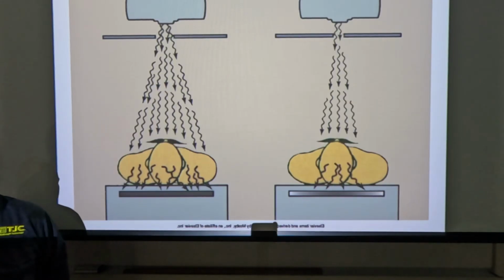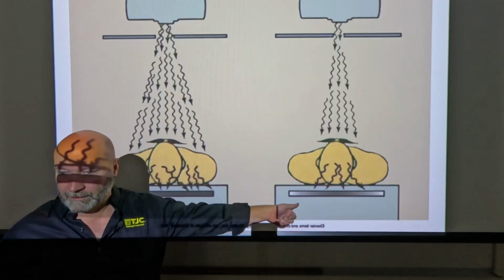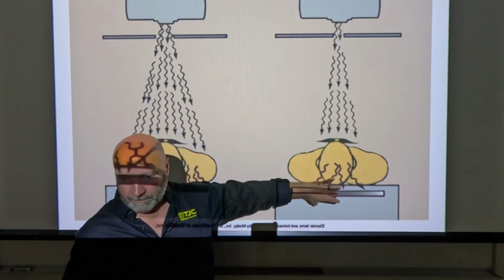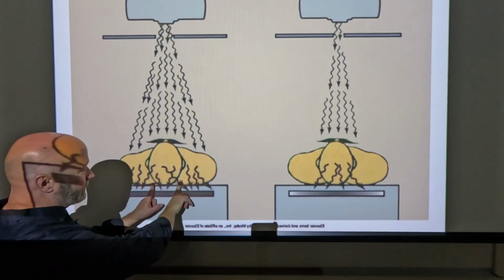I've done well in preaching kVp. Yeah, you probably should increase kVp, but no, for the literature, almost everything is an increase in mAs. Okay, so your answer on the test is mAs. Should you increase kVp? Probably so. But you're going to increase mAs. Okay? And that's your answer on the test question. Increase collimation, increase mAs so that you replace the photons that would be hitting under that T-spine. Okay? So how much of an mAs increase are you going to make? It really depends on how much collimation. I mean, if you collimate to here, it's going to be less than if you collimate to here.